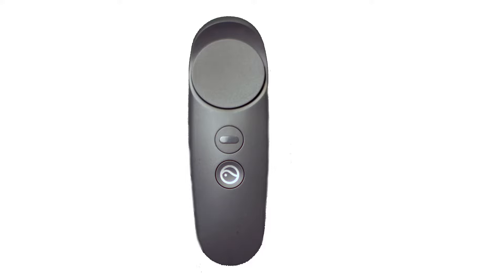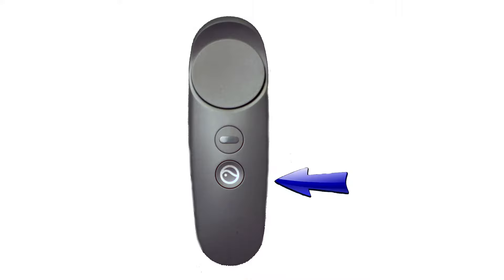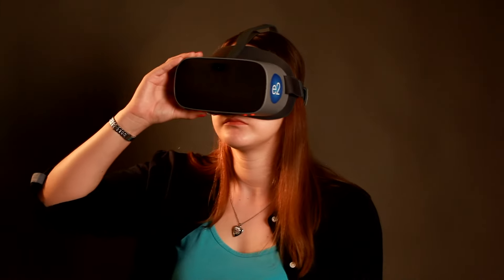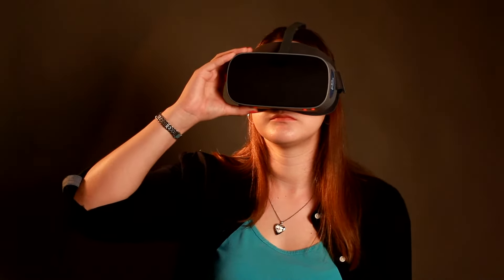Next you'll be asked to sync the handheld remote to the glasses by pushing the home button on the remote. If you need to re-sync the remote, simply press that home button on the remote. The glasses are also fully functional if you do not wish to use the remote — just skip the remote setup and you're on your way.